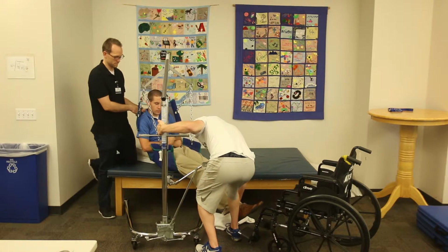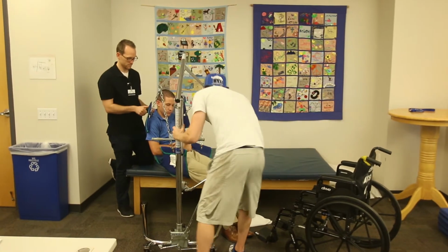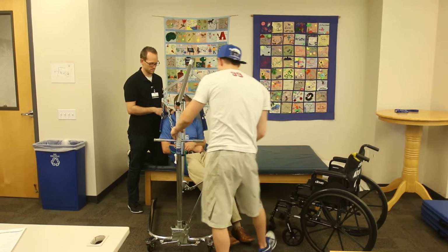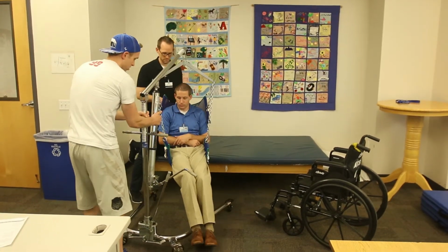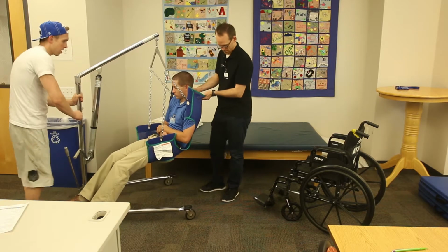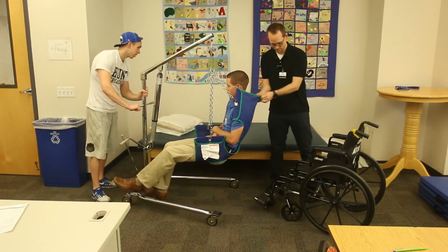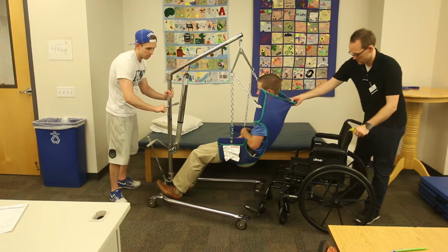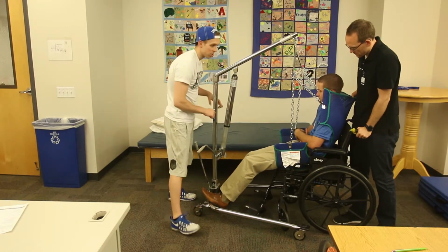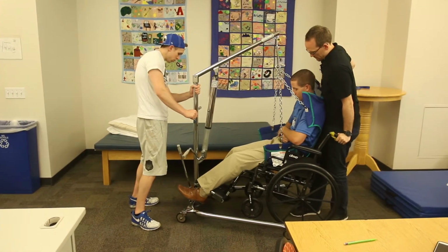Okay, you can kind of let these legs down. Our tail's getting in our way here. Get rid of that. Okay, and now that we're going to go back into the chair, Lucas is going to help make sure that you go to the very back of that chair. Enough clearance there, it looks like. So Lucas, just pull up there, yep, just right on with his back. Even angle that wheelchair a little bit if you want to.